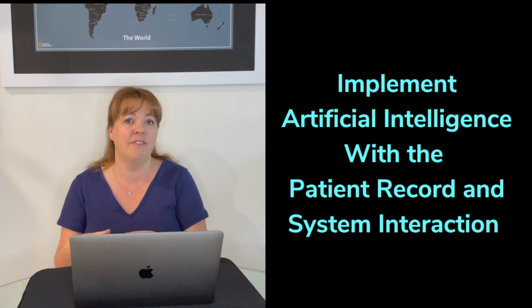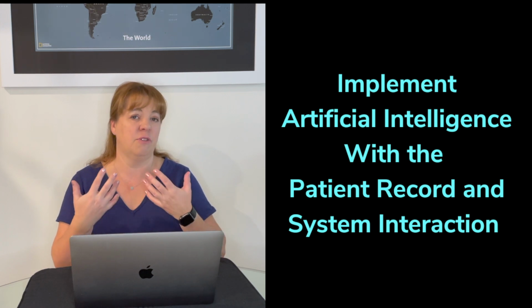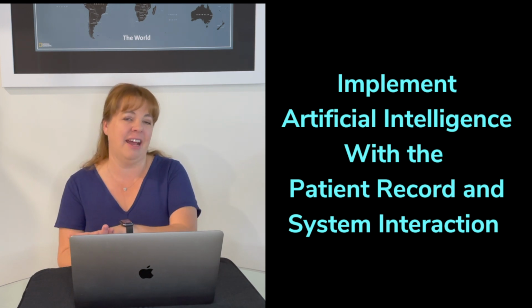So the third and final way that you can incorporate AI into a radiologist or diagnostic imaging department workflow is to have the AI algorithms or the systems that are incorporated with AI actually go to the patient record, but also have the ability for an interaction between the radiologist and that AI system directly. So you do still need to have absolutely a review process in place. You need to have the transparency and the change management. You need to have really good synergy between the individuals who are working on those AI systems as well as the radiologists that are using it on a daily basis.